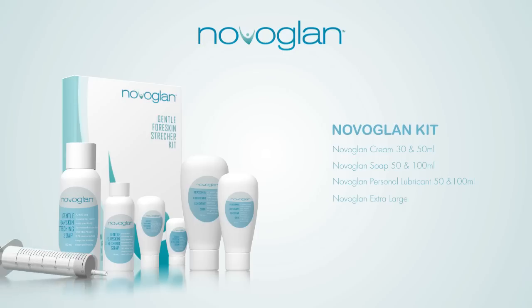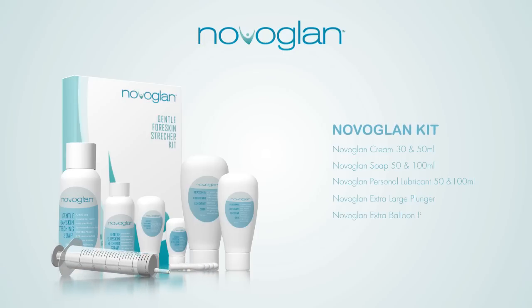NovoGlan Extra Large Plunger. NovoGlan Extra Balloon Pack, or Pax.